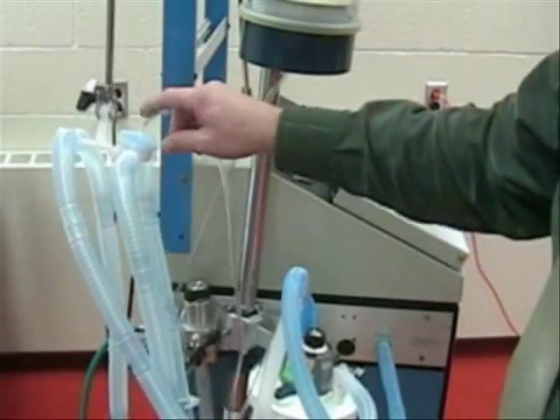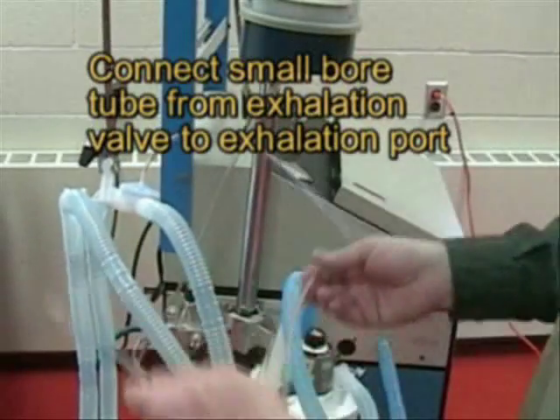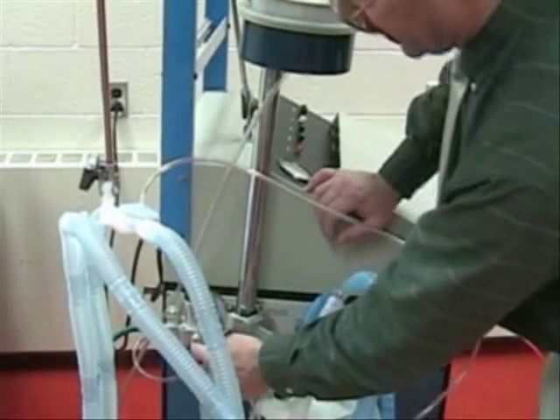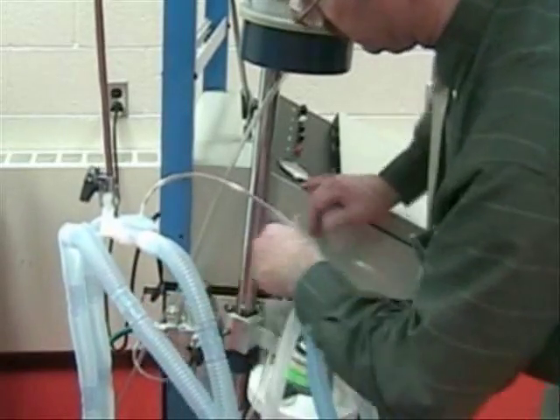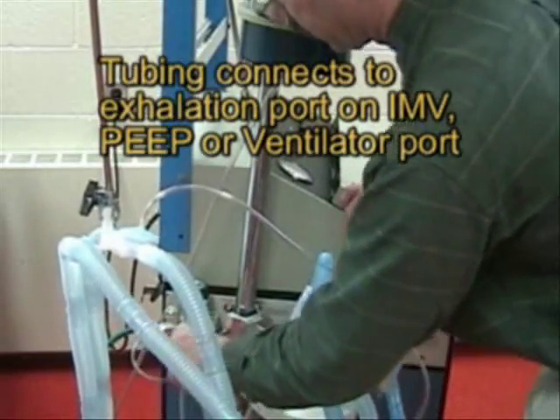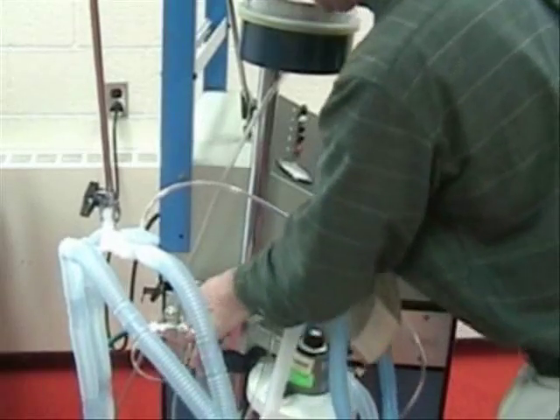The only thing we have to worry about is the exhalation valve. There is a tubing that goes from the exhalation valve into this connector on the demand valve, or if you're not using it, goes to this port here. We're going to use the demand valve, so we'll put it on the demand valve port and make sure that this is connected.